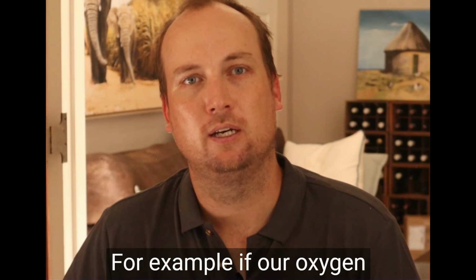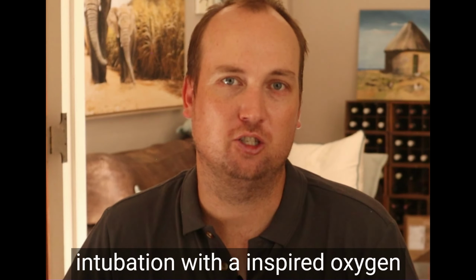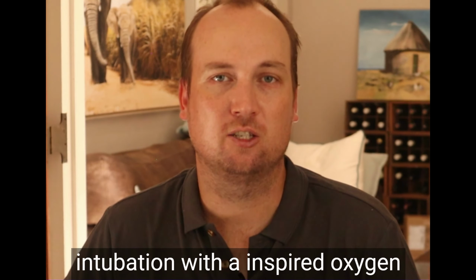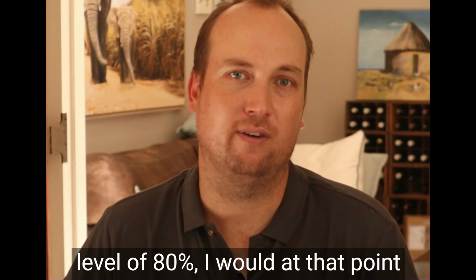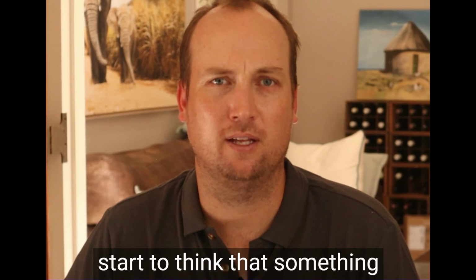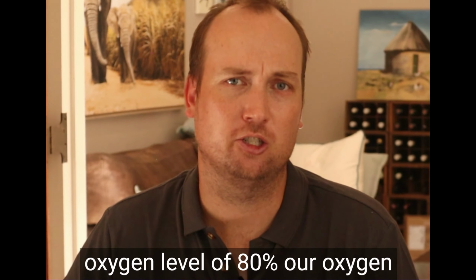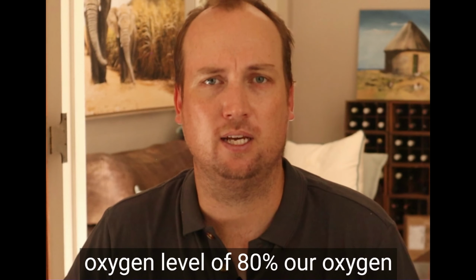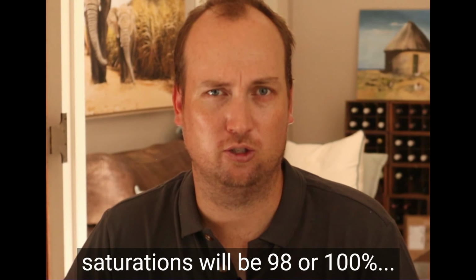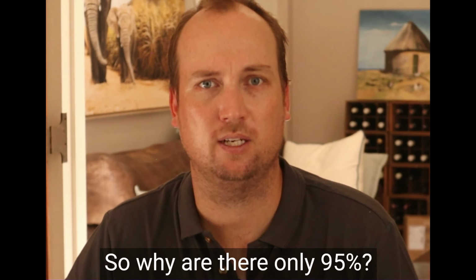For example, if our oxygen sats are 95% immediately post-intubation with an inspired oxygen level of 80%, I would at that point start to think that something might be wrong, because I would expect that with an inspired oxygen level of 80%, our oxygen saturations will be 98 or 100%. So why are they only 95%?